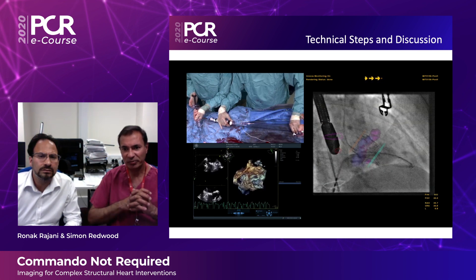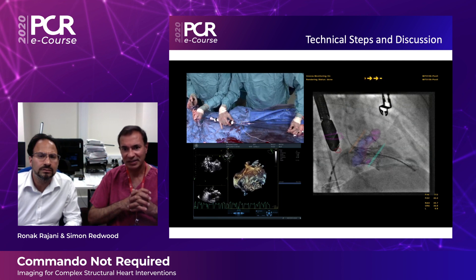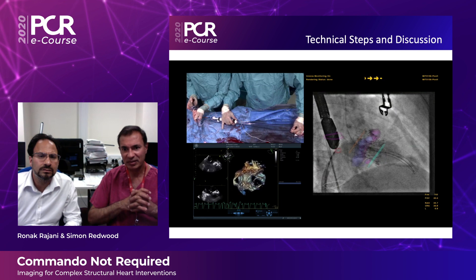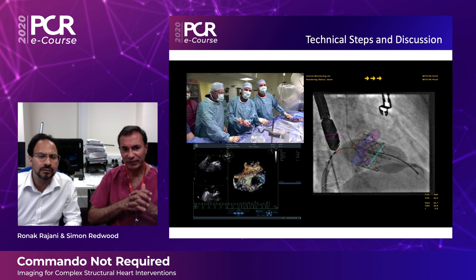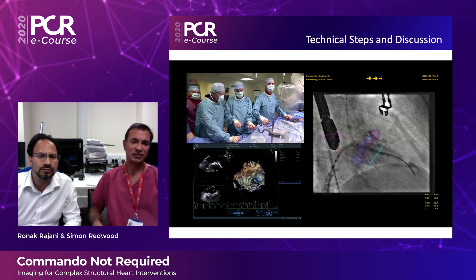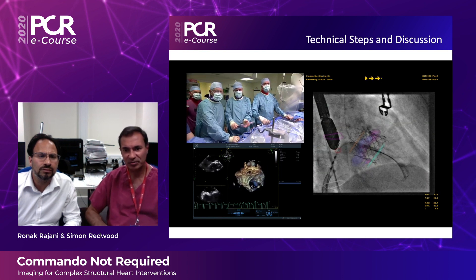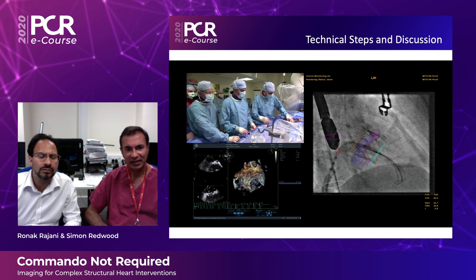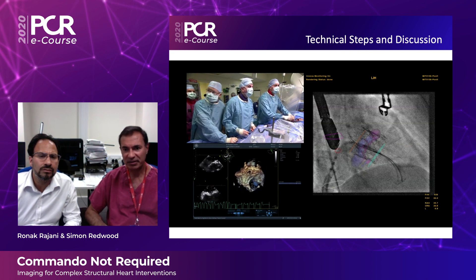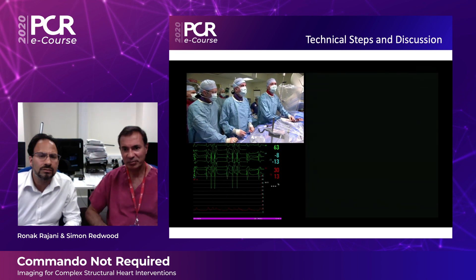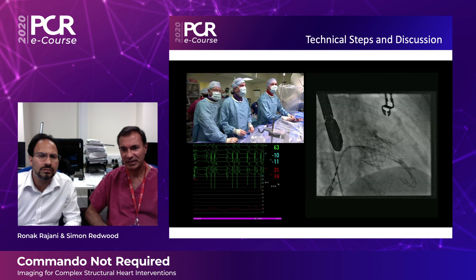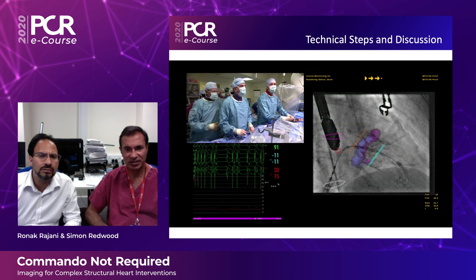During valve deployment you can see I'm pushing the whole valve forward in order to make it coaxial with the mitral annular calcification. Following deployment you can see the transesophageal echo on the bottom left. It's then simply a matter of removing the device and checking with both transesophageal echo, and we also performed left ventriculography to show that there's no significant mitral regurgitation.